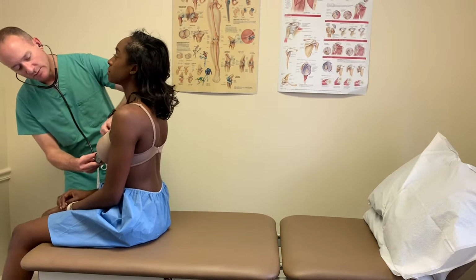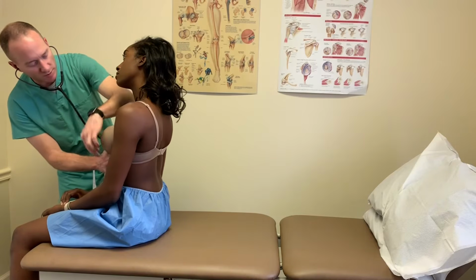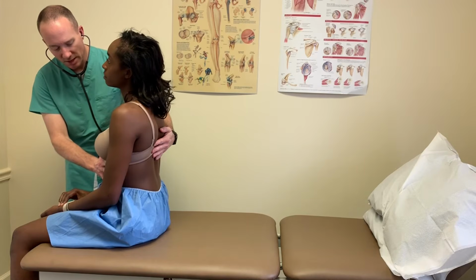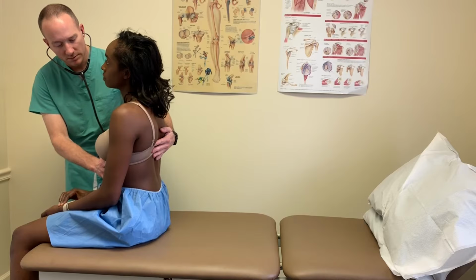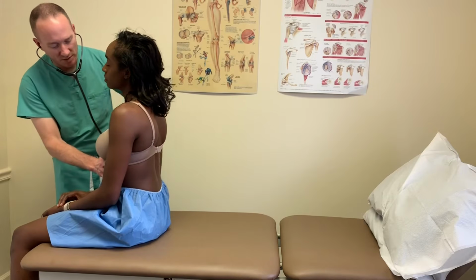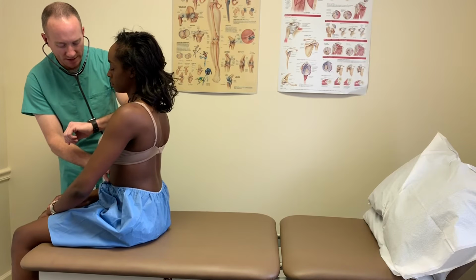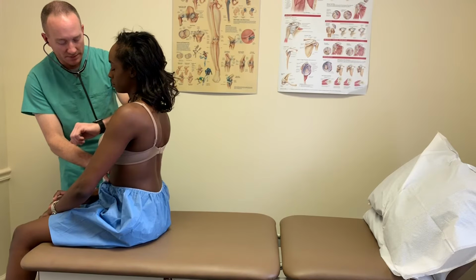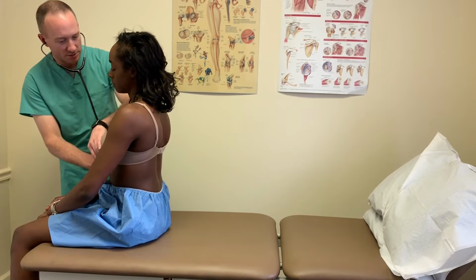And then I'm going to move down to the fifth ICS, mid-clavicular line, displace the breast tissue upward, and I'm going to listen here for the mitral valve, mitral sounds at the apex of the heart, or the point of maximal impulse. Now I'm going to auscultate for 1 full minute. I've already begun the counting, and count your pulse rate. Okay, we've been a minute, and we have a pulse rate of 62.